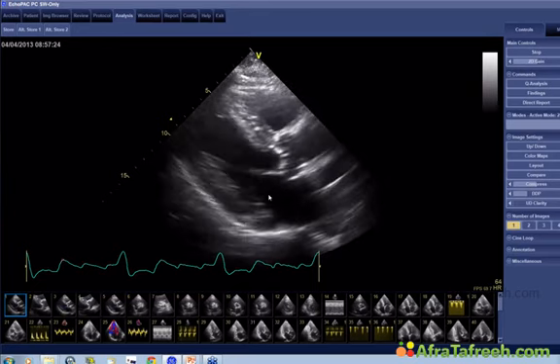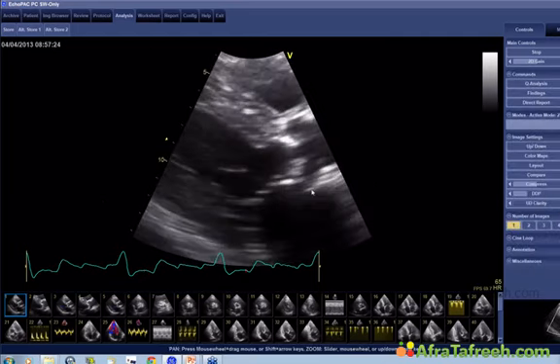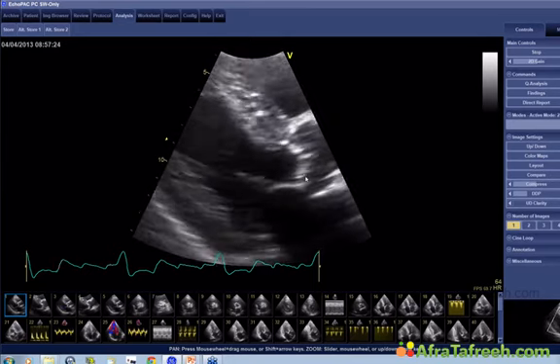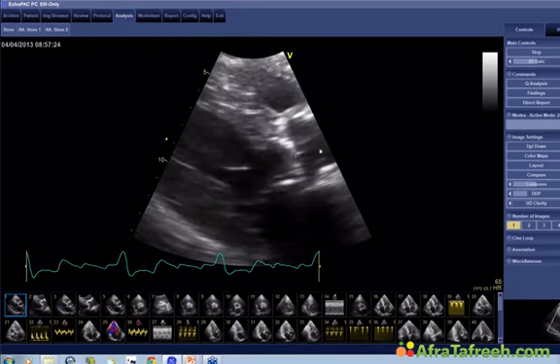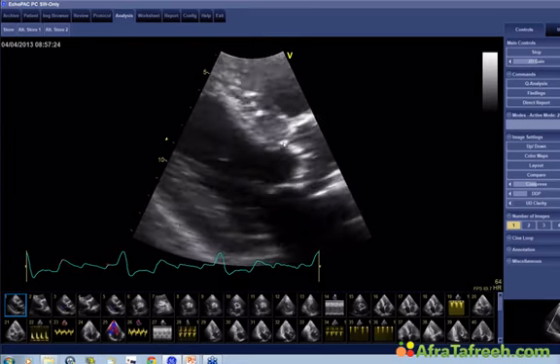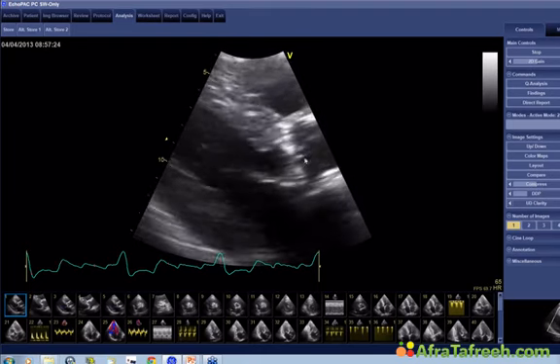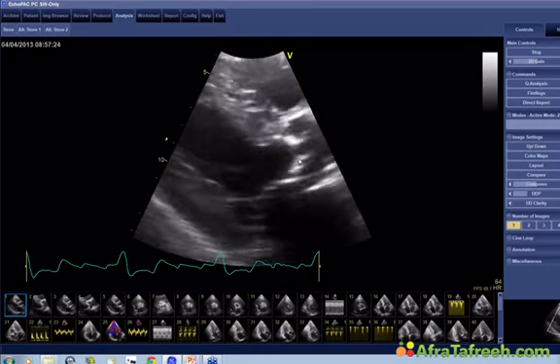And then the next thing I look at is the aortic valve. So I'm going to focus in on the aortic valve, and here I look at several things. The first thing is the presence of a bicuspid valve, so doming, for example, which is not present here. And secondly, I look at the opening excursion of the aortic valve, as well as the degree of calcification.